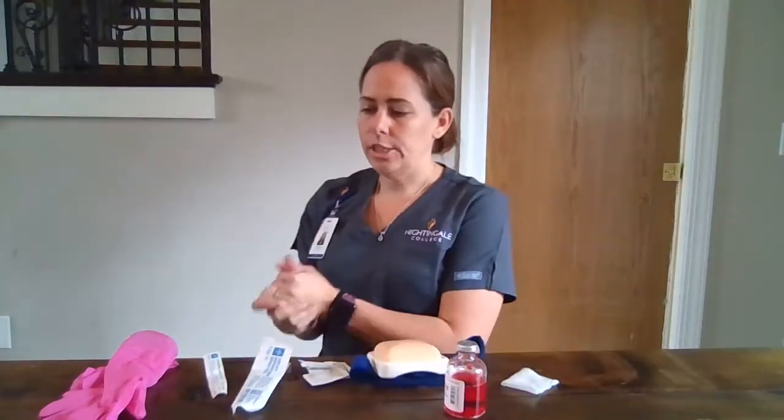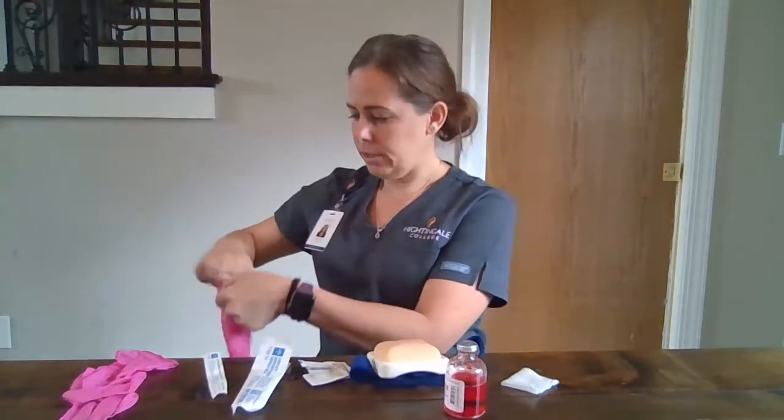Also, some people complain of some burning or stinging with the administration of this, so just be aware. Do you have any questions? Okay, so we're going to do our hand hygiene and put on clean gloves.